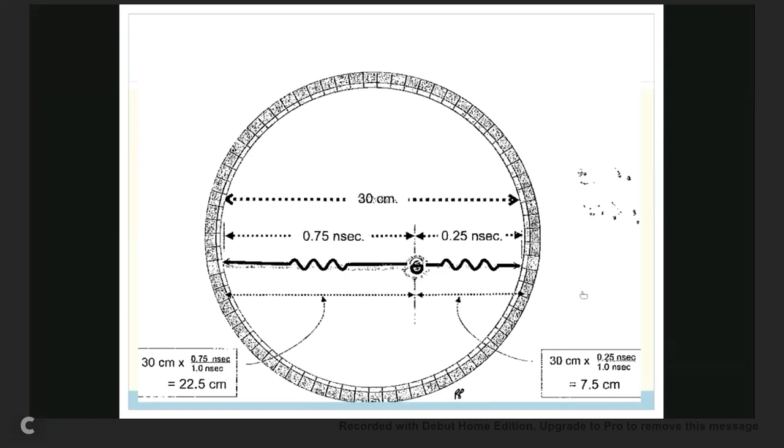Okay, that's fine. So anything following after that, the resolution gets not distorted, but it's not as accurate as the one that hit the detector first. Okay? Yeah, but I mean, there's no way we can control it. That's correct. That is very correct. But that's why you have the software correction.